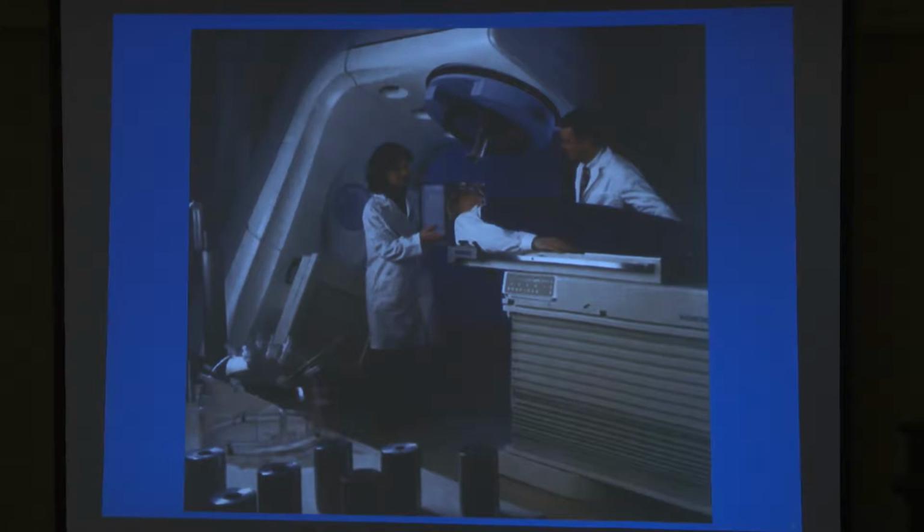And I kind of lobbied and worked to get our Gamma Knife, which was the first one that we had on Long Island, which we opened about 16 years ago at South Nassau. But this is what these earlier machines look like, and the person would be secured here. For most of the treatments, people are using head frames. Sometimes they're using very rigid face masks. Obviously, it's critical if you're giving this super focused dose during 30 minutes, 60 minutes, the head must be rigidly immobilized. So the person's going to be here, and then once everyone steps out, this machine is going to deliver whatever set treatment that we want it to deliver.